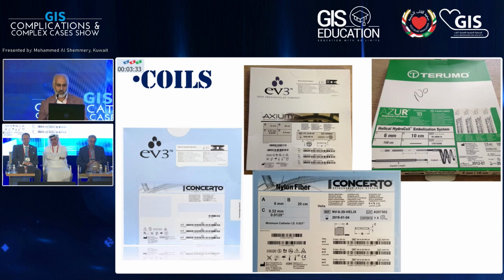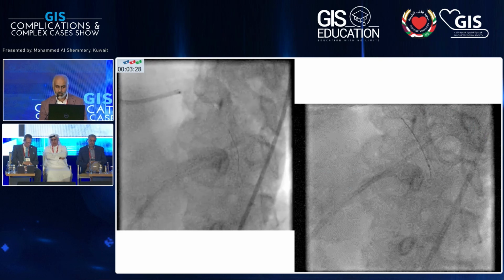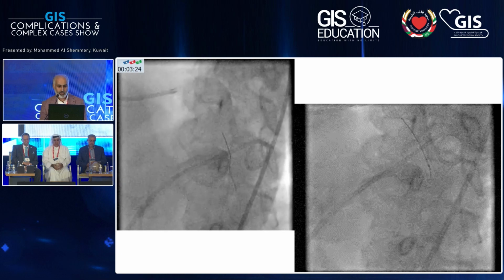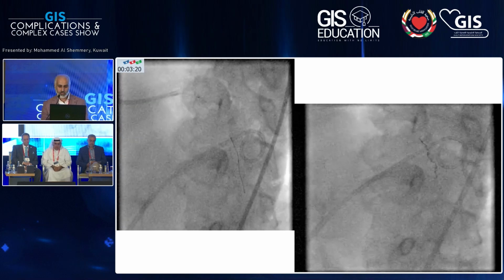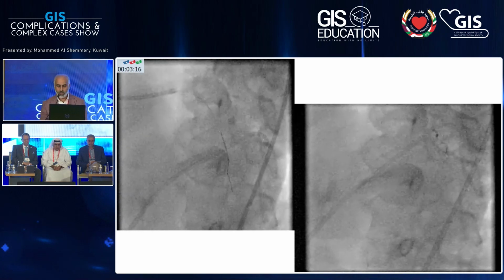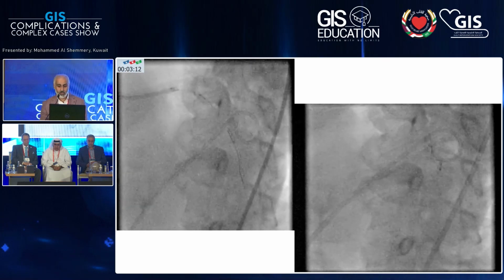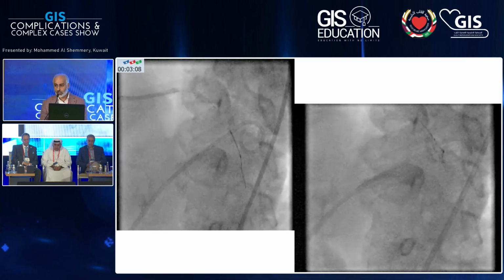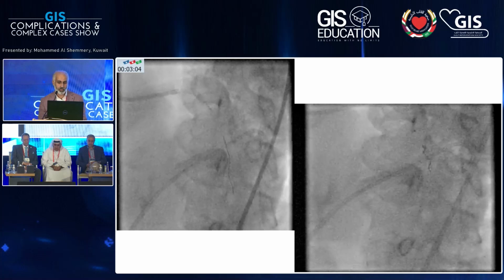So in our cath lab at that time, we had the Axiom. So we took a FineCross microcatheter, which is a 1.8 French microcatheter. In the first picture on the left, you could see we're exchanging the wire with the microcatheter. And in the second picture on the right, the first deployment of the Axiom coil, which has the option that you can deploy it, but you don't have to detach it unless you're completely sure that you sealed the perforation.